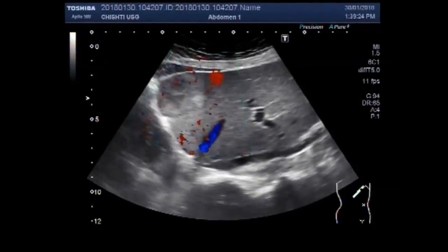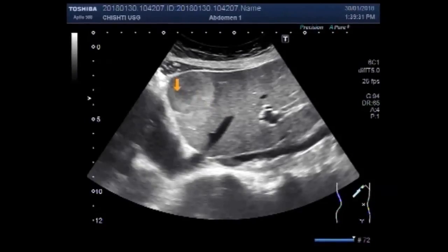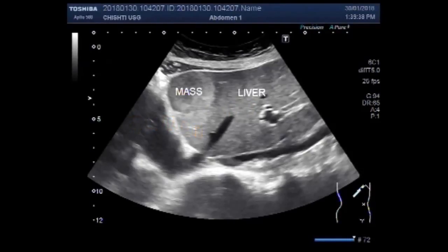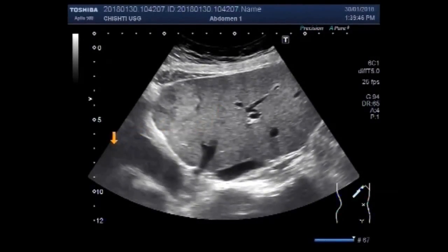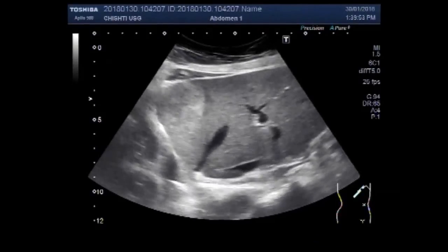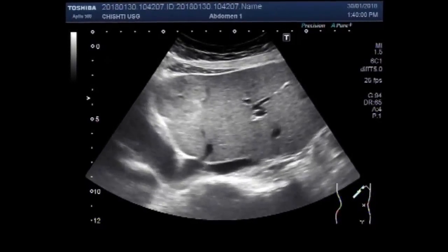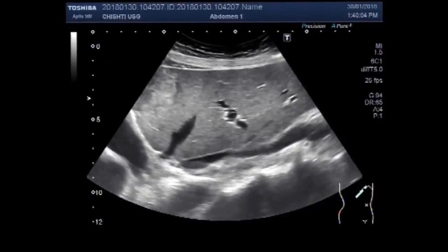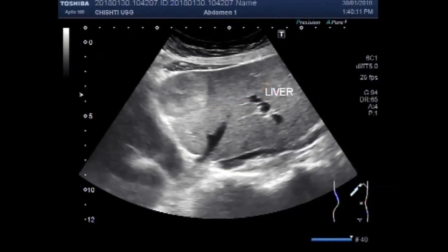A fair amount of blood flow is also seen in it. This is the mass, this is liver, and this is heart. You can see the liver with a small amount of blood flow. This is liver and this one is the mass.